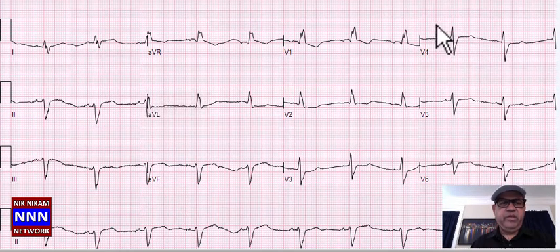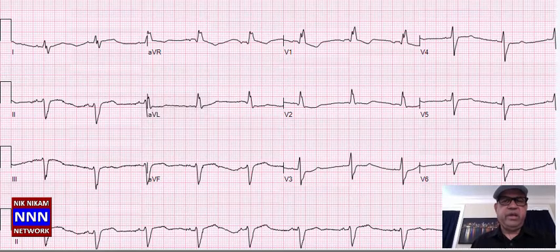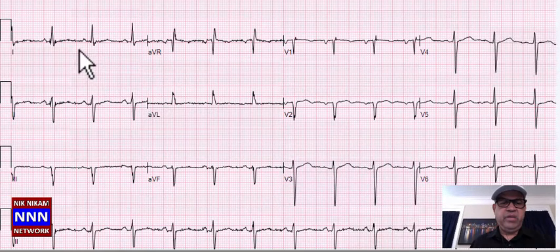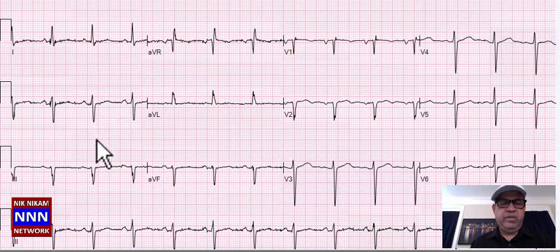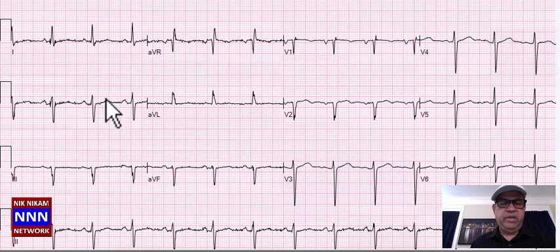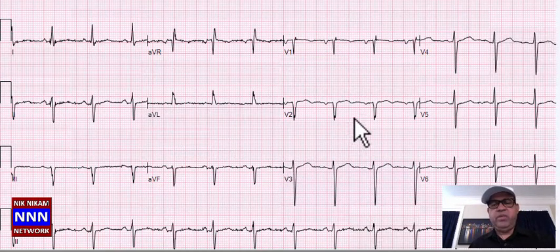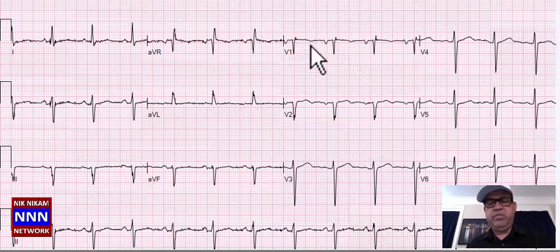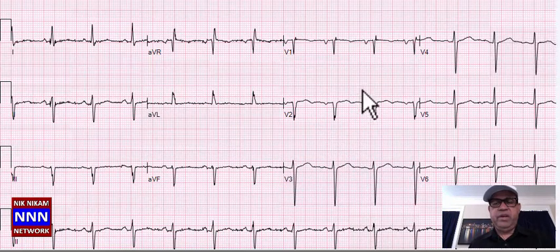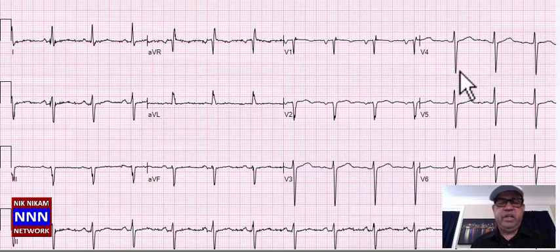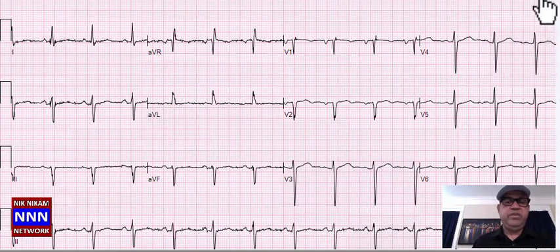Sinus rhythm, left axis deviation, left anterior hemiblock, right bundle branch block, non-specific ST-T changes — some of the findings in this EKG. Here again: sinus rhythm with non-specific ST-T changes, left axis deviation, left anterior fascicular block, old anteroseptal myocardial infarction, left atrial enlargement, non-specific ST-T changes in the lateral chest leads.